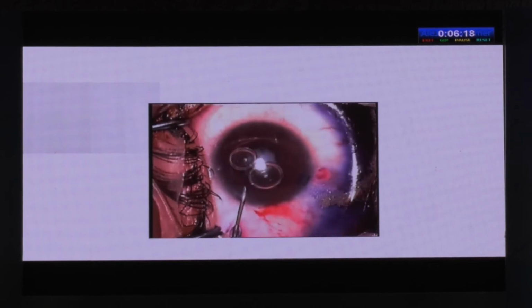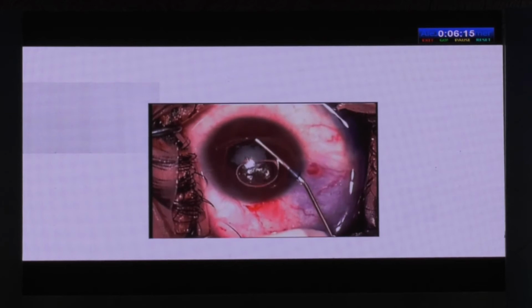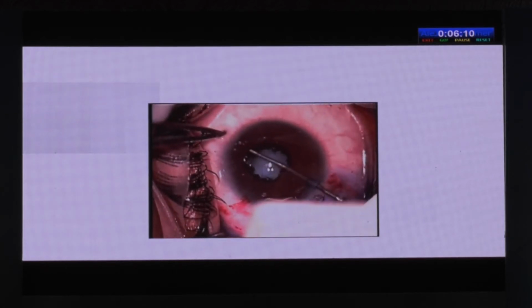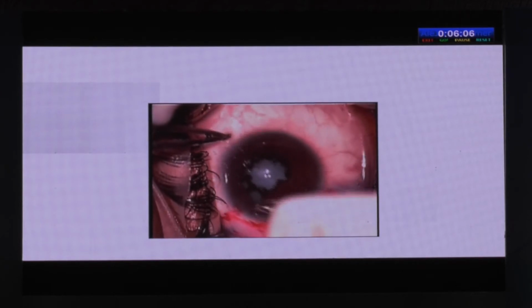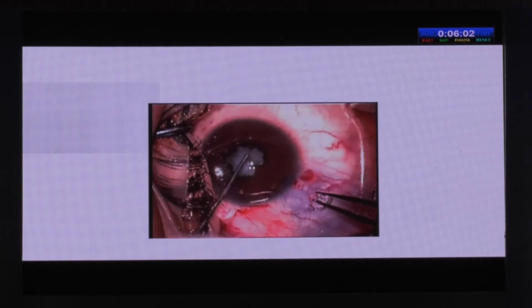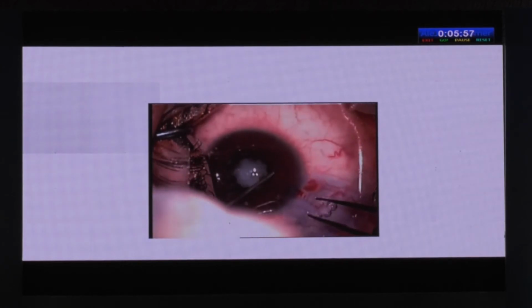Remember, in children the cataract is intumescent and the rhexis can run peripherally. You need to separate the synechia. The rhexis visualization is difficult, and sometimes it can run off. And in children, you don't want to put a sulcus lens or an AC or a scleral fixated lens because they have severe uveitis. So the pressure on you to have an in-the-bag lens is very important in children.